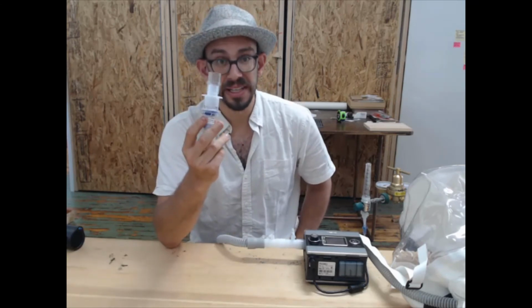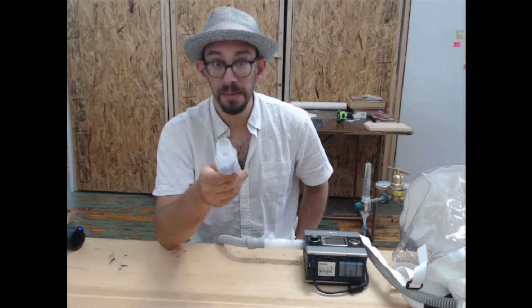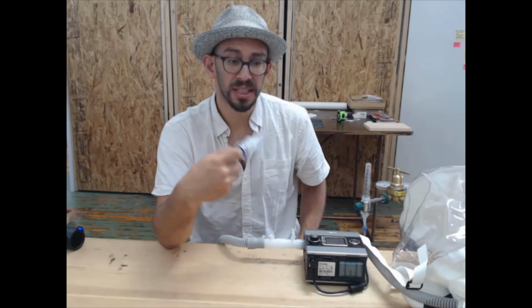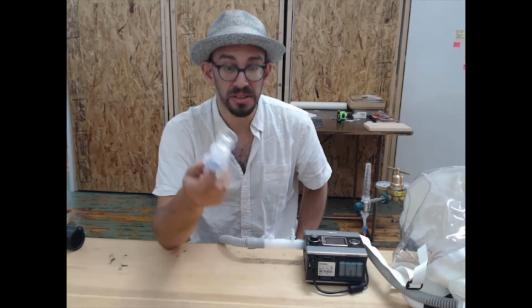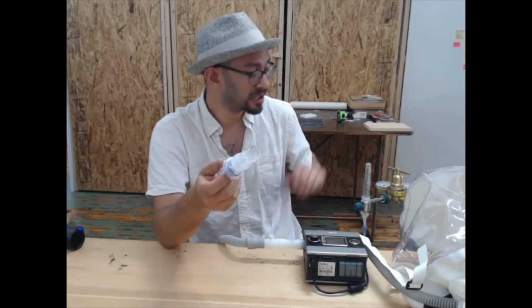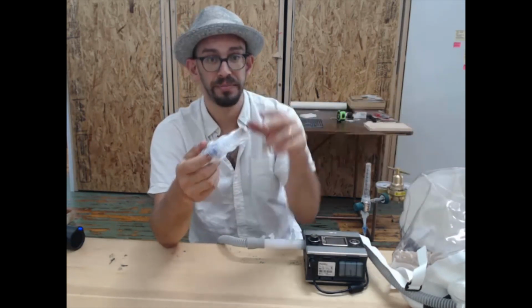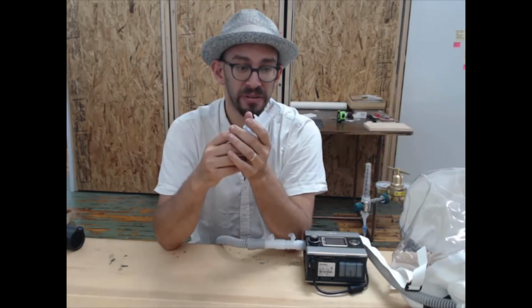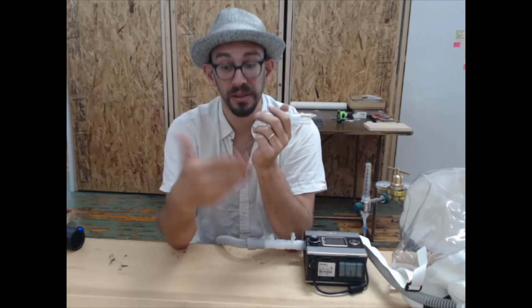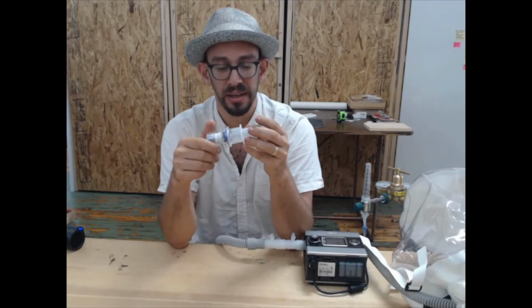We're using this PEEP valve as a flow restrictor more than to set pressure. The flow restrictor at high pressures is reducing the amount of total flow that goes through, and we keep it above 50 liters a minute, but it reduces the total flow. And what this does is it means that a certain amount of oxygen delivered will achieve a higher FiO2. Without a PEEP valve, you may not be able to hit higher pressures, or you may dilute your oxygen quite a bit because you are flowing a large amount of air through your circuit.